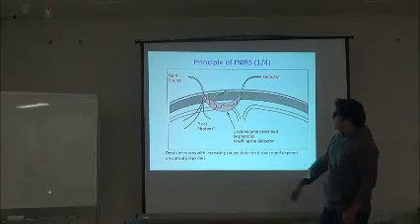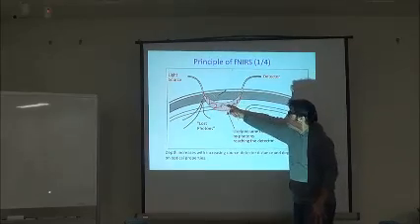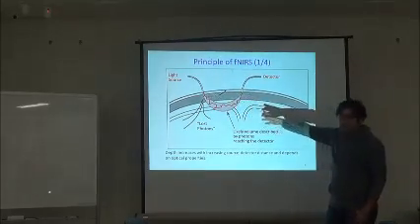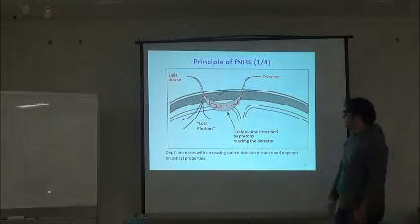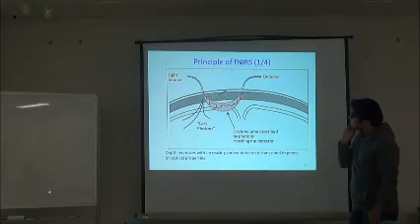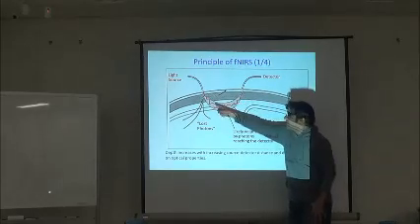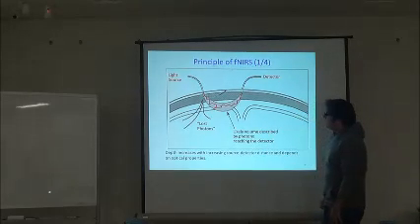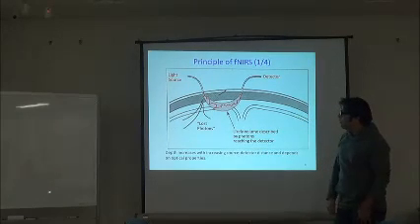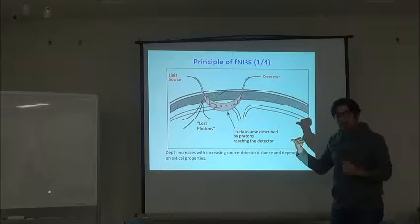Most of the detected photons roughly follow this banana shape, and other photons get absorbed or attenuated, so they are not caught. But the photons do not come straight like this. They scatter in between. They go through multiple scattering and go here. So when we use the modified Beer-Lambert law, we will have to use the distance that the photon travels to reach the detector. How would we estimate this distance? That I will tell you later.